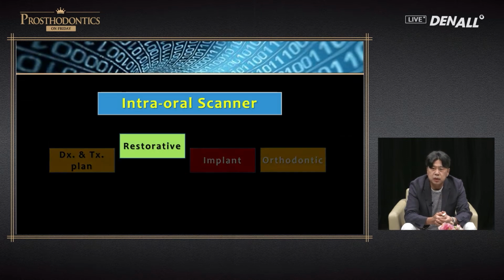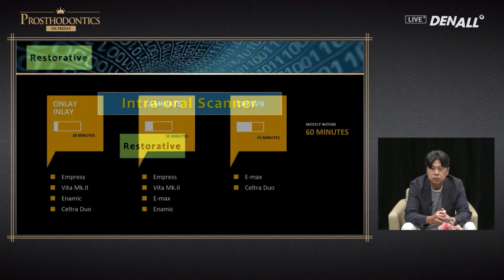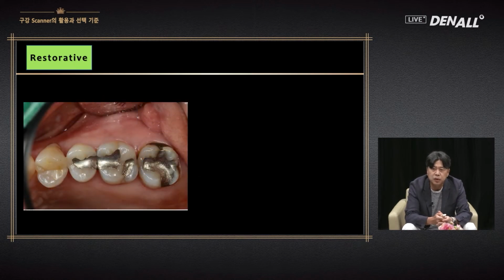The second, restorative. I talked about it briefly in the first lecture. I'm a prosthodontist, and this is used quite a lot by me. Inlay-onlay, laminate, crown or bridge, materials and software were introduced last time. Using this in the clinic, the treatment can utilize the digital images.